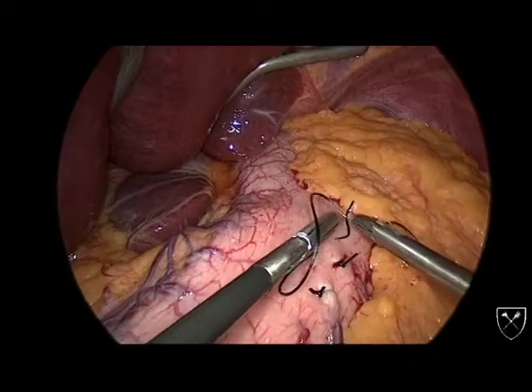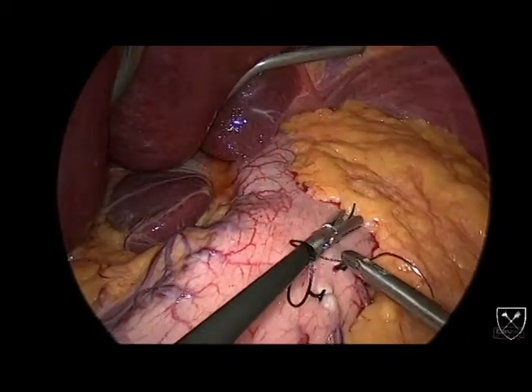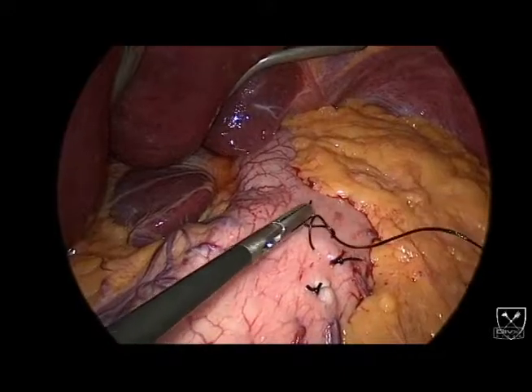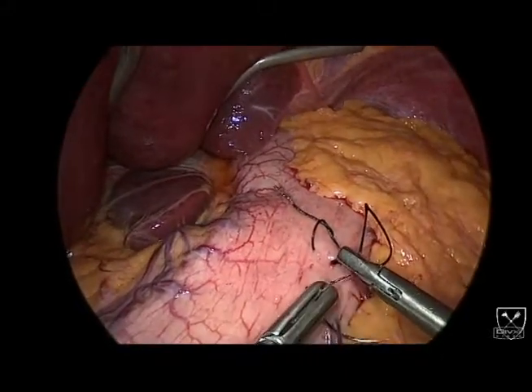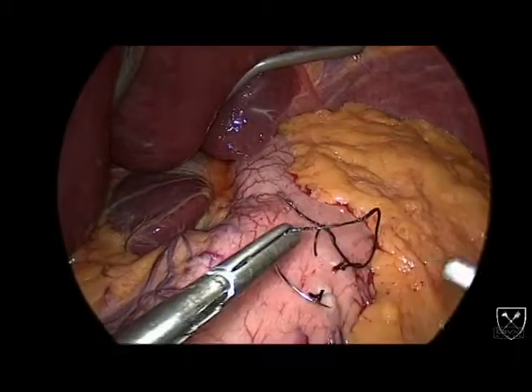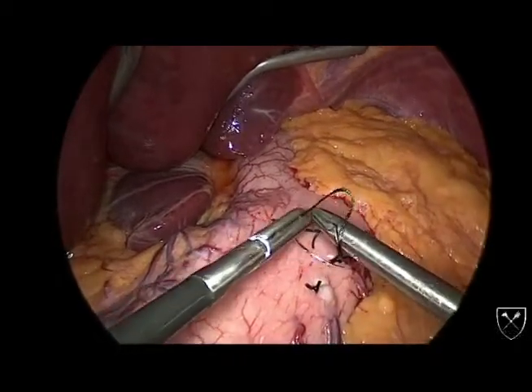Here are some additional tips and pitfalls that will help you form better knots. This is a shorter suture, and the shorter the suture is, the more you need to adhere to minimal grasp motions while looping over the seat. Otherwise, every little movement will pull the tail into awkward positions.